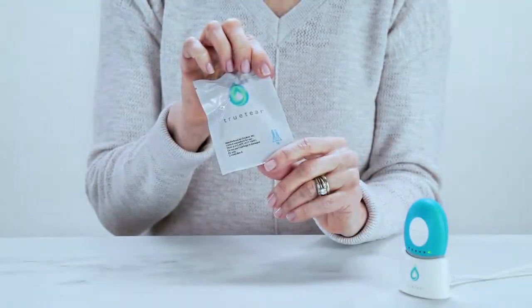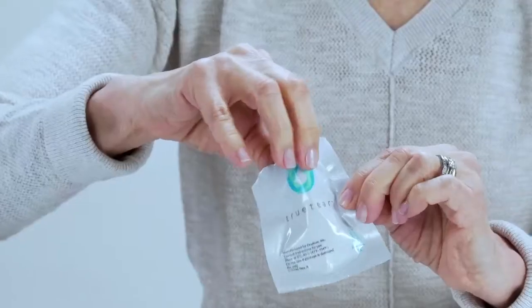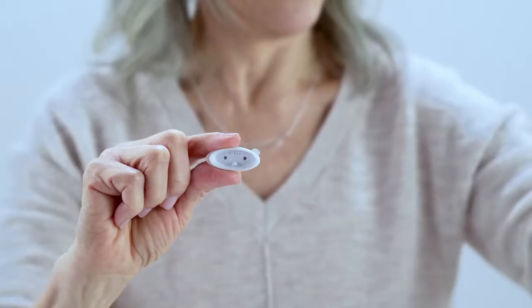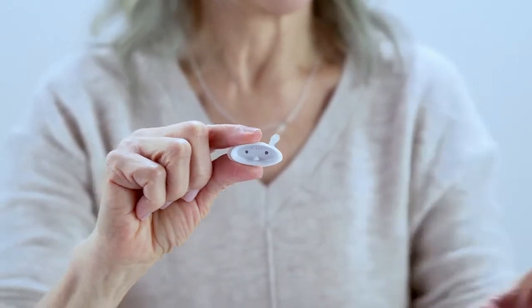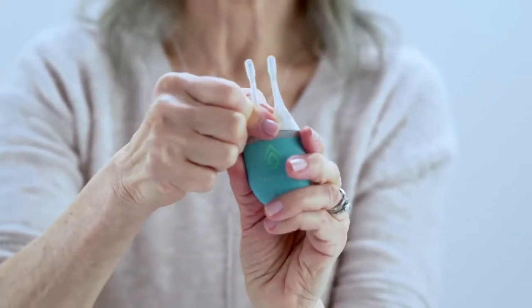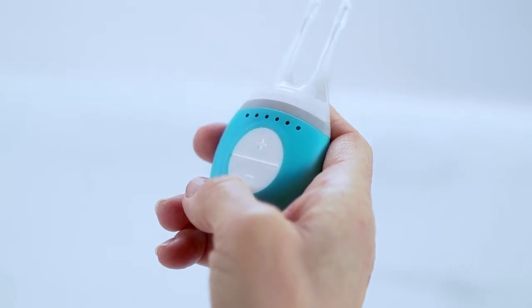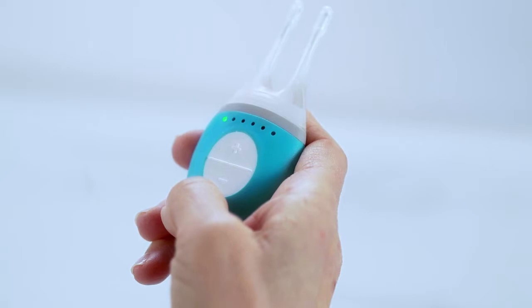Start by removing the tip from the pouch. Then grab the tip by the bottom to avoid touching the hydrogel. Next, snap the tip onto the base unit. You will see a notch on the bottom of the tip that will help you secure it — the tip only fits one way. Once the tip is on the base unit, press the plus button for two seconds. A single green light will appear to indicate it's on.